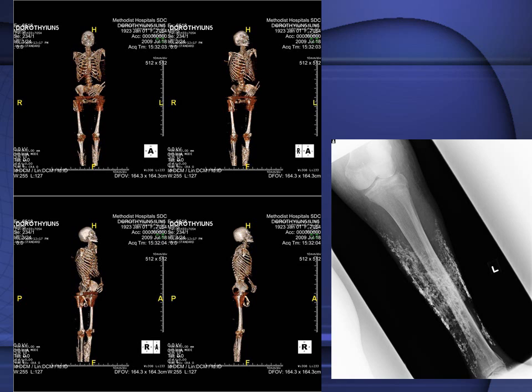And we did this because when we took the x-ray of this individual, Dorothy Purcell, we saw that she had densities in the tissue of her leg. And when we looked at this on the CT scan, we saw that it was bone, and we actually did histological sections of her skin and saw bone in her skin.